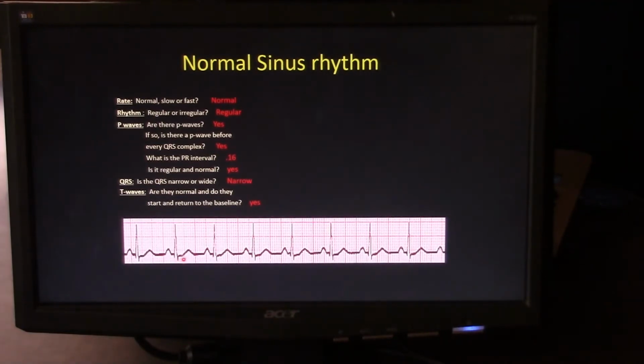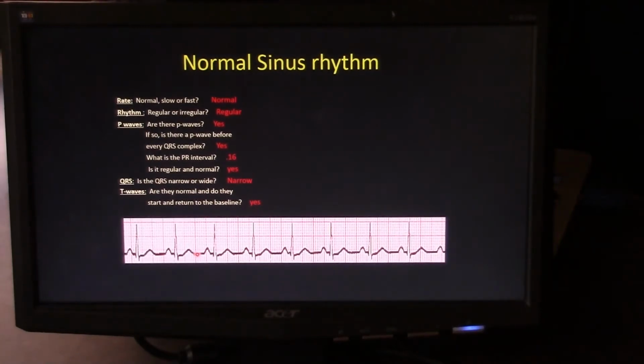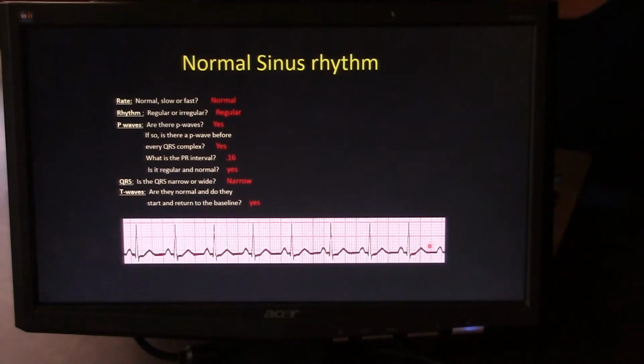The T wave, does it begin and end at the isoelectric line? Yes, it does. The QT interval here is the beginning of the Q wave, or QRS complex rather, to the end of the T wave, and it should be less than 13 boxes wide or less than 0.50 seconds. So if we find a QRS complex that starts near or on a dark line, here it is, that's 0.20 plus 3, 0.32 seconds in width. That's less than 0.5, and that is good.